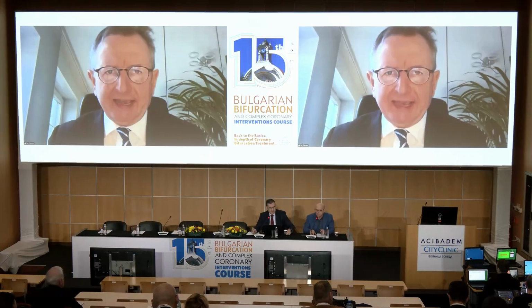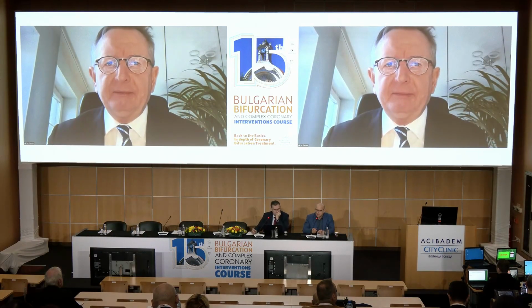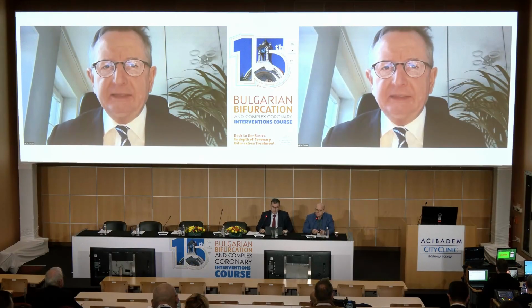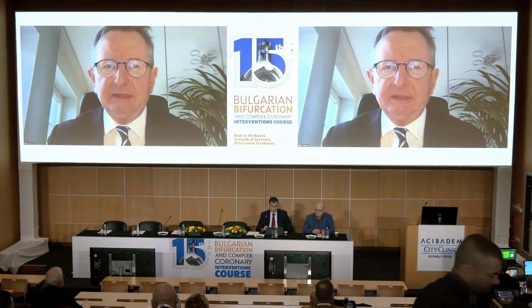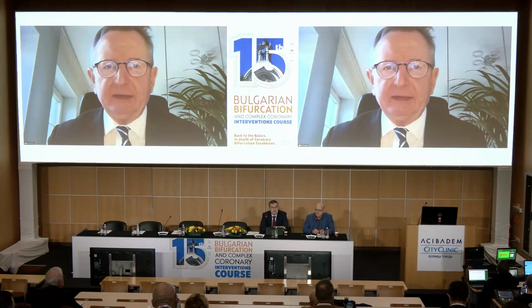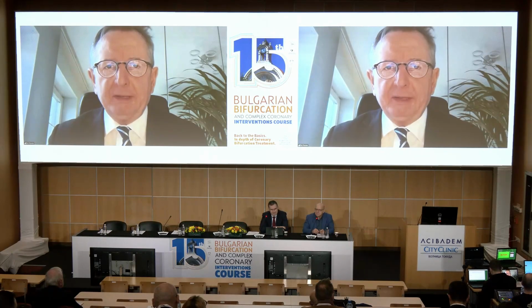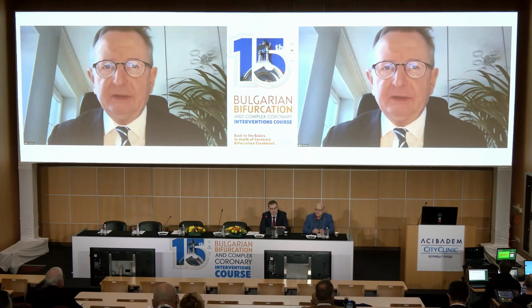Thanks. But again, I think the point is to go with NC balloon. If the balloon doesn't open, and if there's really a subtotal lesion, then a rotablator. If the vessel is tortuous, I'm going with orbital, then usually IVL on top, and then confirmation in imaging. If the plaque is prepared well, then you can go with stent implantation.